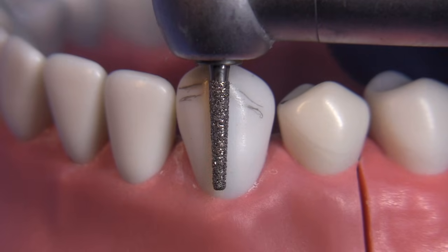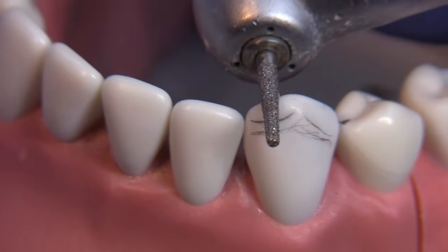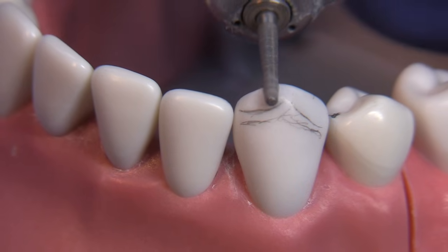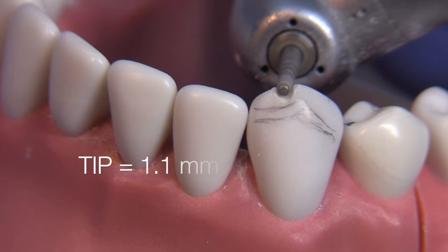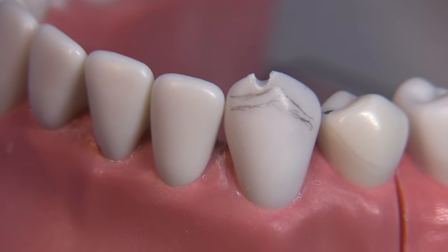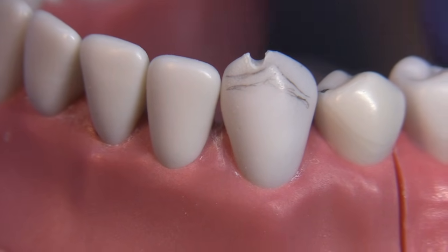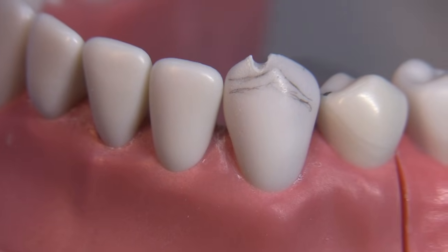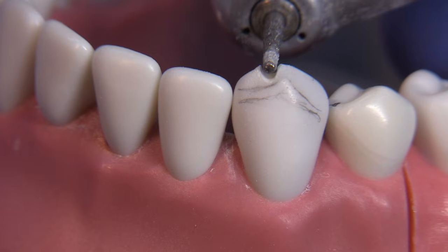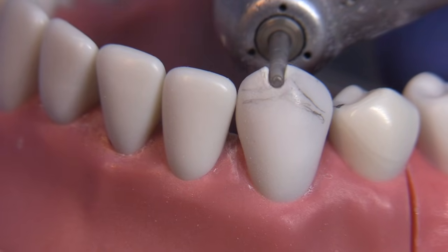Let's get started on the incisal reduction using an 847 KR 016 bur. This diamond has the dimensions we want for facial reduction and also allows us to reduce the incisal really easily. We'll start with maybe a one millimeter depth cut — the tip of the bur is 1.1 millimeters, giving you an idea of depth. We'll continue to almost the entire two millimeters, leaving a little bit at the end for smoothing so we don't end up with an over-reduced preparation.